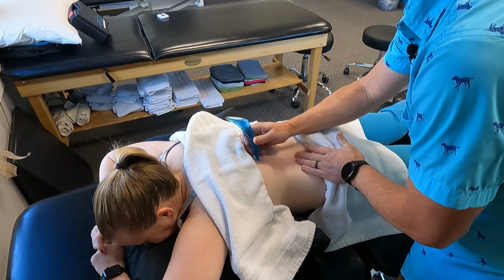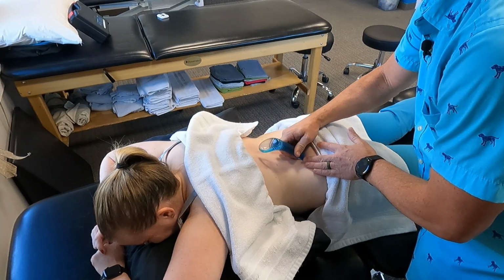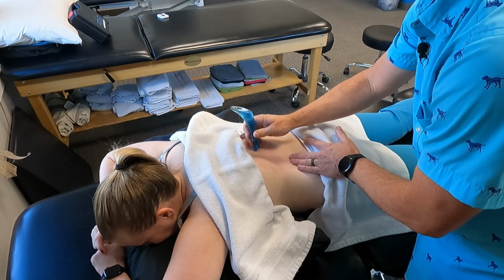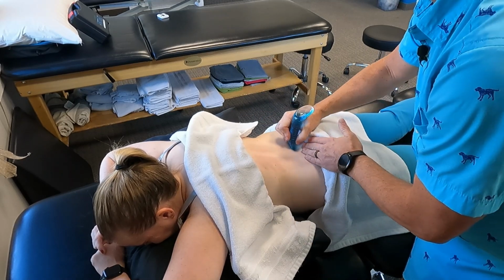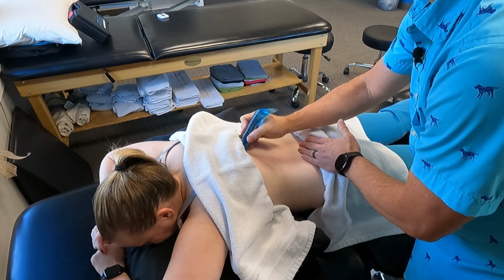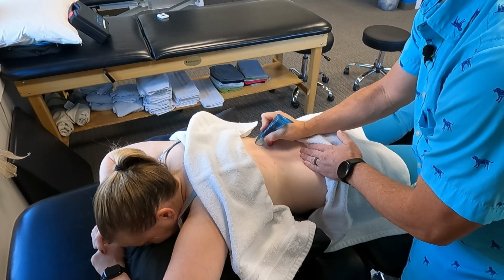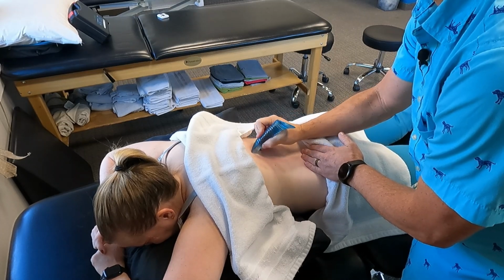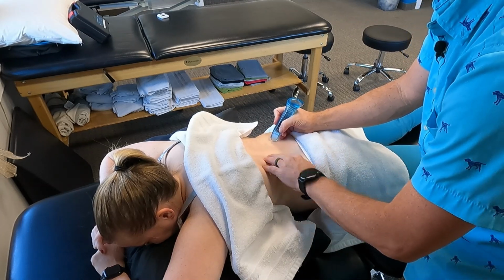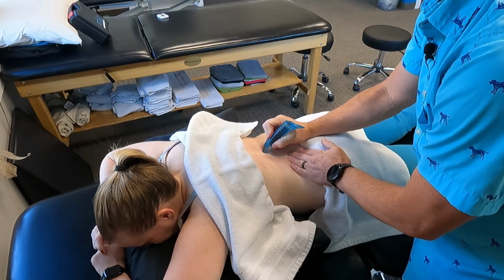aggressive. So then I'm using different sizes of tools to work deep into those paraspinal muscles. It's kind of a general scraping technique for the back. I use this on a lot of my back patients, just to hit the different areas. Think about where the muscles are and where the spine is. With Amber, we have a curve that goes to the right here. That's why this concavity is there. So just think about what you're feeling with the tool.